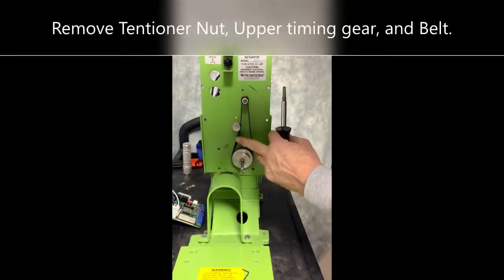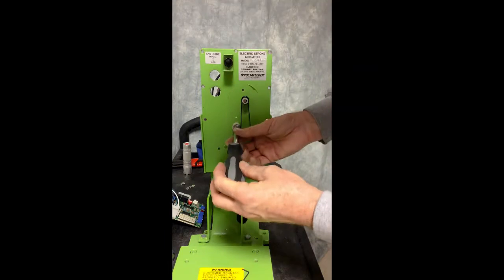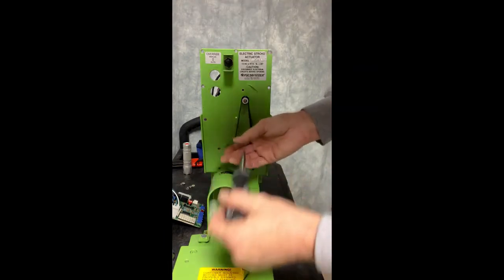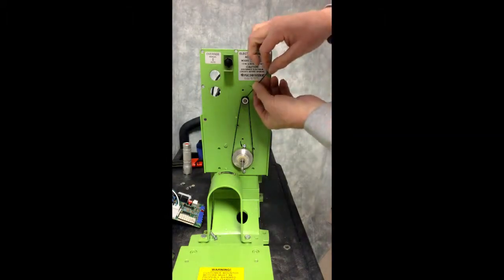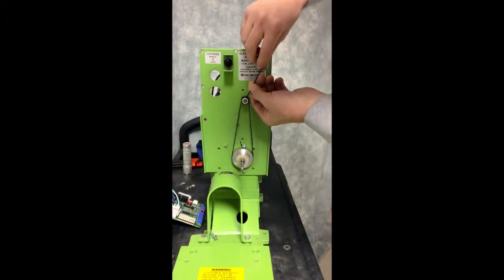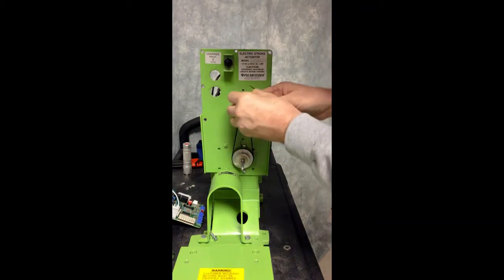Next, you want to relieve the pressure on the belt so that you can remove it. To do that, you're going to remove the spacer. Then, using the 1/8 inch Allen head, you can loosen this up and slide this off, removing the belt.